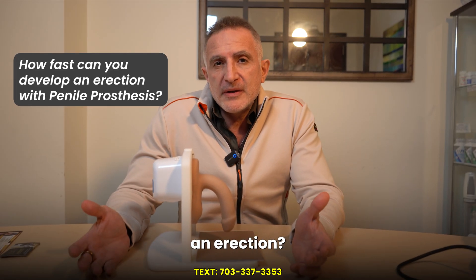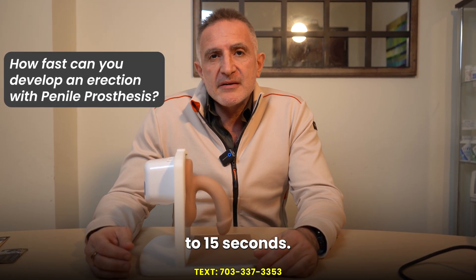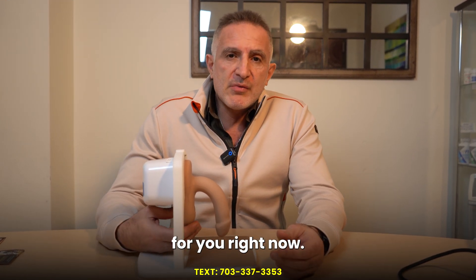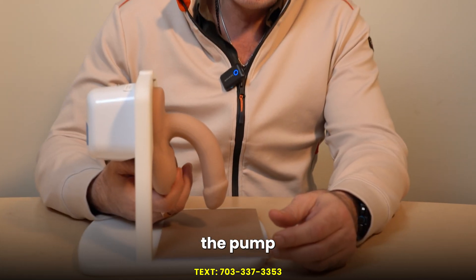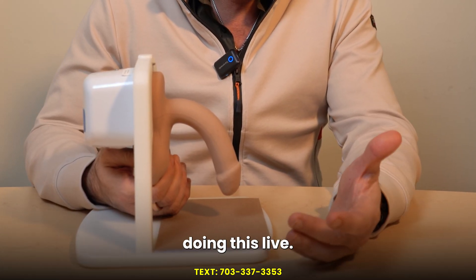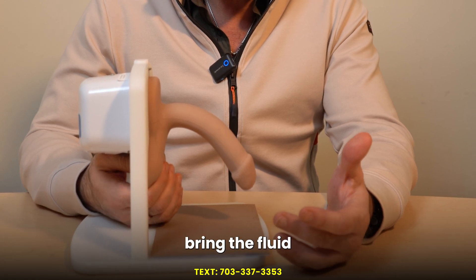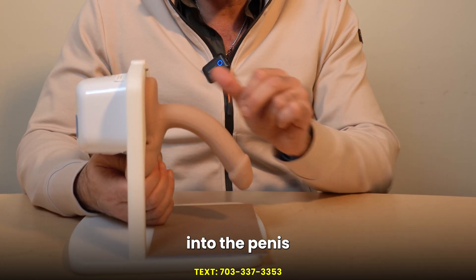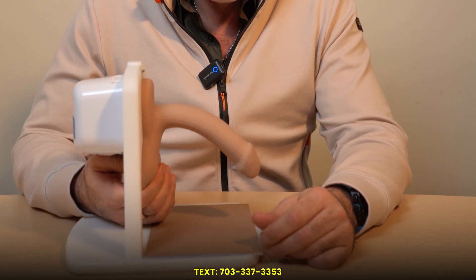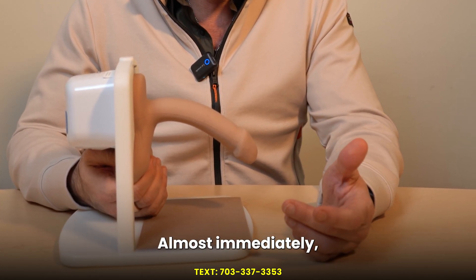How fast can you develop an erection? The answer is between 5 to 15 seconds. So I'm going to demonstrate for you right now. You find the pump inside of the scrotum and you squeeze it several times. You can see easily how you can bring the fluid out of the reservoir into the penis within seconds and get a very hard, rigid erection almost immediately.